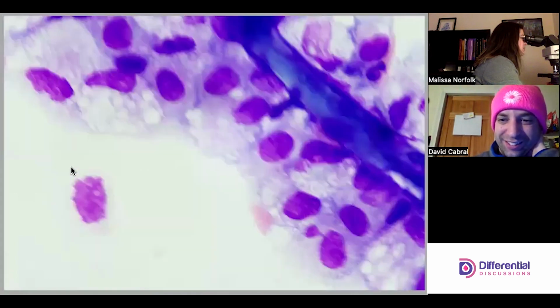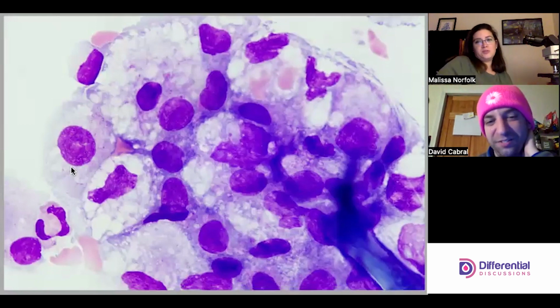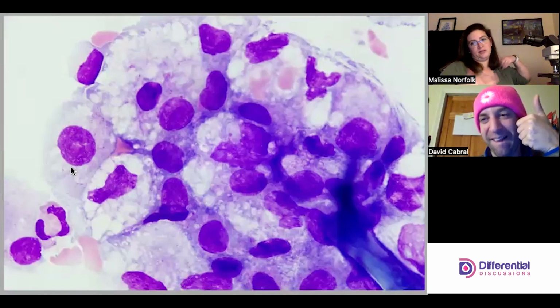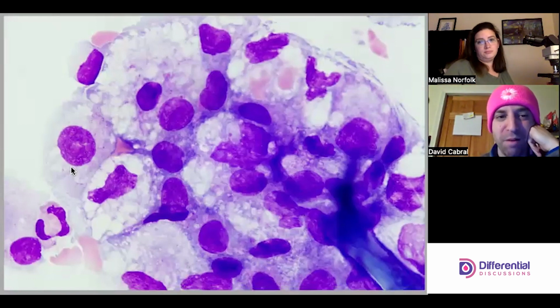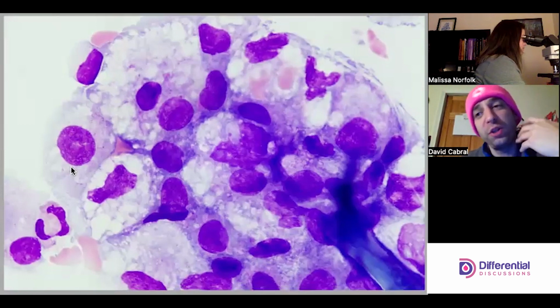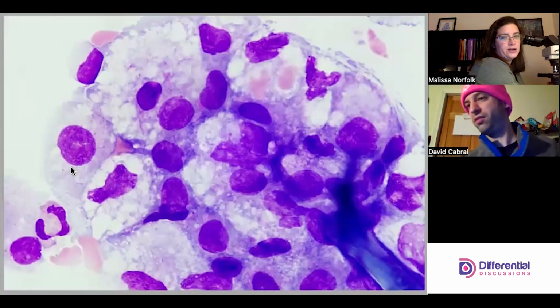But that was a good clump. And the other thing is then this clump. This looks mostly like a giant clump of monos and neutrophils and whatever. I agree. It's tough to enumerate here, but it doesn't look dark and scary and ugly.